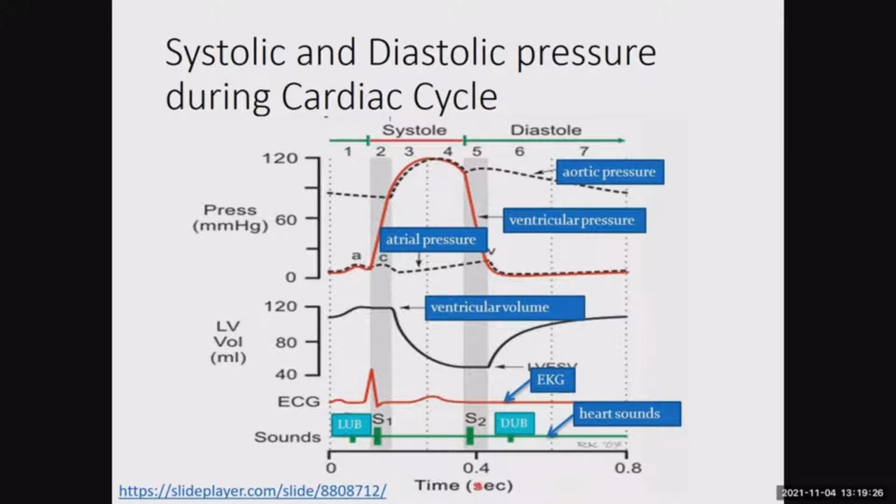Now, it's not part of the assignment, but you are going to have a stethoscope and a blood pressure cuff. You have the opportunity to try to listen for the heart sounds. Again, the first sound, the lub sound, is associated with the ventricle starting to contract, blood flowing back towards the atria, causing our AV valves, our atrioventricular valves, to slam shut.